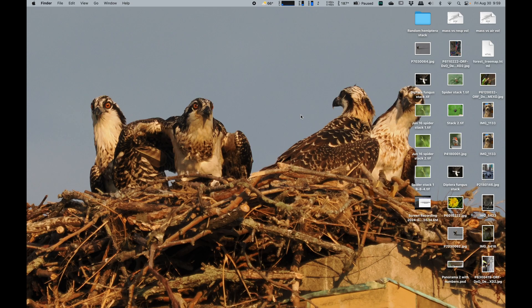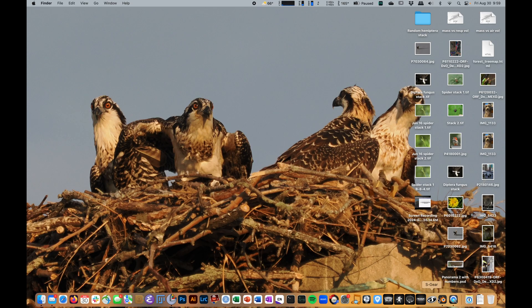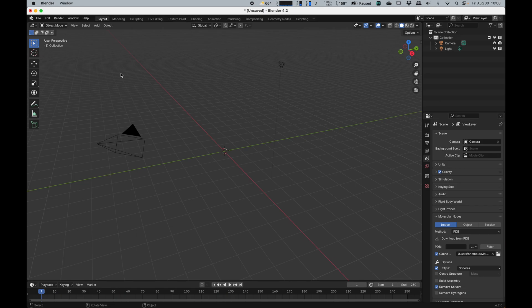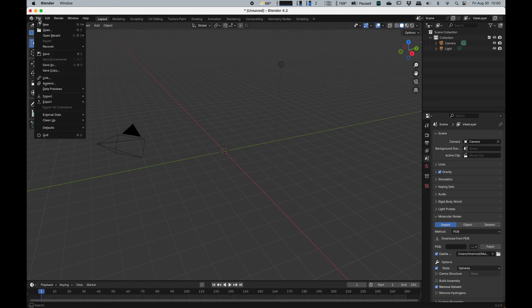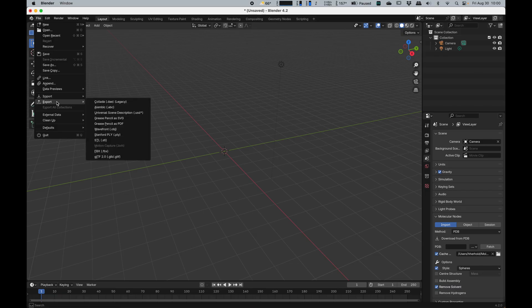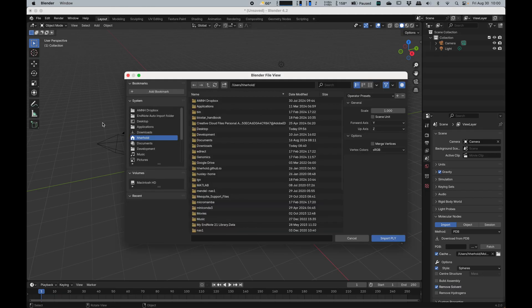Now I go over to Blender here. In Blender, I go over to where my stuff is and say import PLY files.